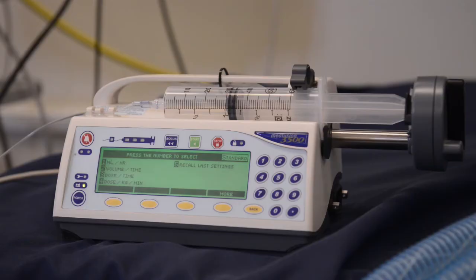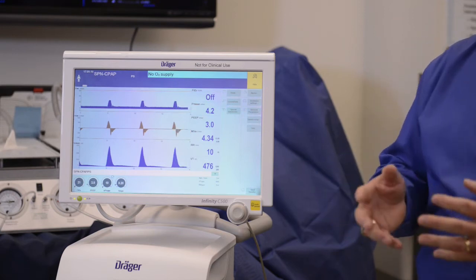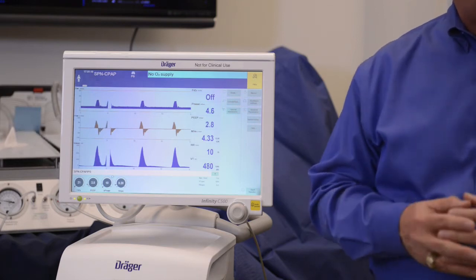Well, my name is Jim Serene, and I'm from Smiths Medical, and we brought with us our Medfusion hospital syringe pump. And I've hooked it up to a software program to remotely control it, so we can allow nurses to operate the pump from outside the containment area where a patient might be present with Ebola. What we'd like to demonstrate today is using our SDC open protocol, which is a published protocol that can be utilized by other device manufacturers or information system vendors to allow true interoperability to not only share data, but also to allow potential control of the device using open standards that are not proprietary.